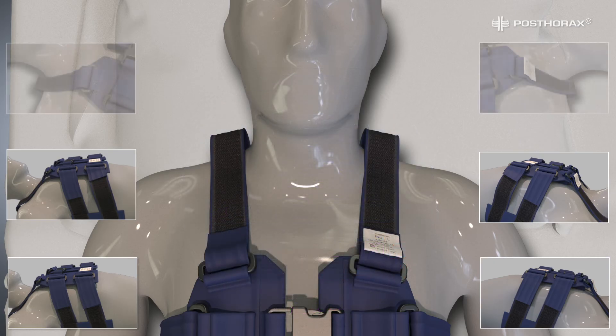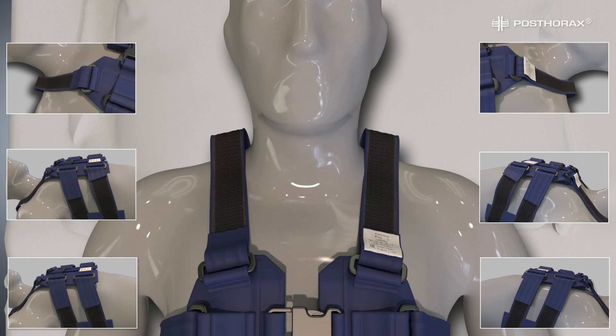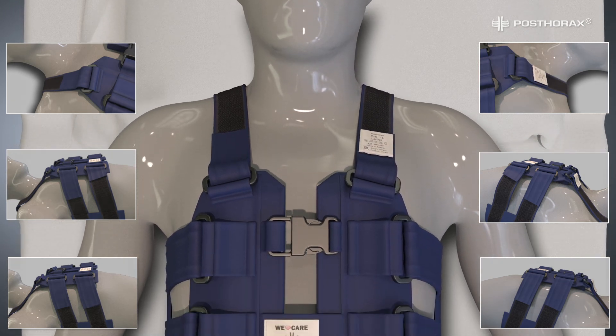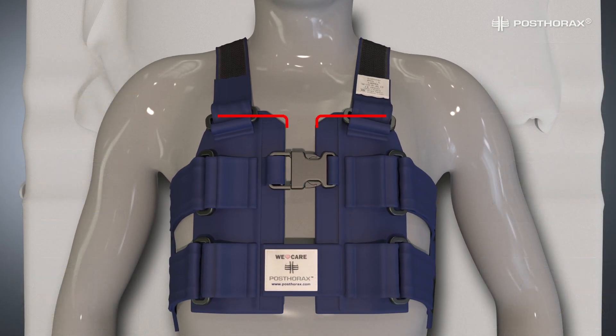To complete fitting the Postorix vest, adjust each shoulder strap separately. Pull until a slight tension is achieved and fasten the Velcro closure in that position. This is required to prevent the top of the cushions from moving. Repeat the same with the other shoulder strap. Now make sure both cushions are placed squarely to the chest and adjust them if necessary.